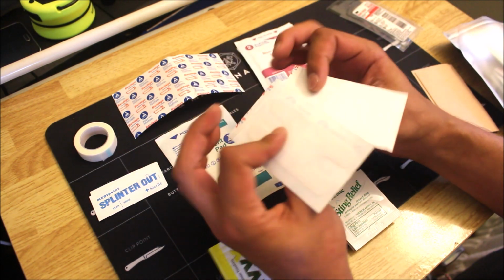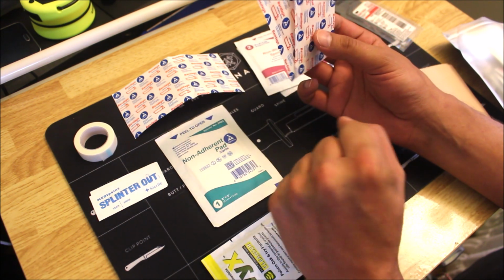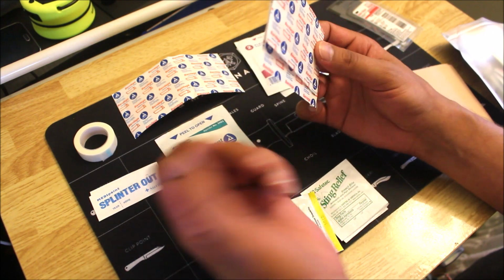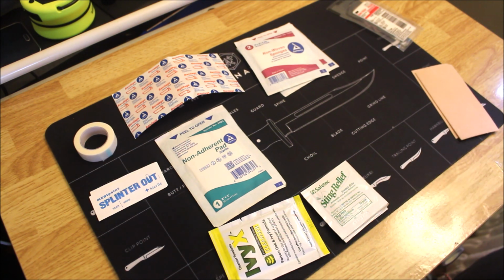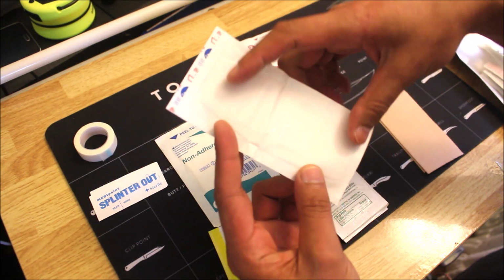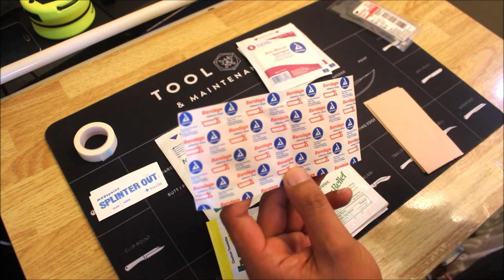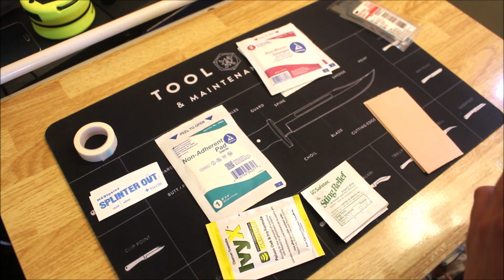Alright, then we have 2 knuckle bandages. You know, when you get cuts on your joints and things like that, that's the worst place. It takes forever to heal. You can't get regular Band-Aids to stay adhered, so it's always good to have a few knuckle bandages to help with that. So cool deal. Alright, then we have 1 giant bandage here for larger cuts and wounds and things like that. Let's see, I think it's 5 3/4 by 3 inches wide. So that's good to have there. A nice big bandage.